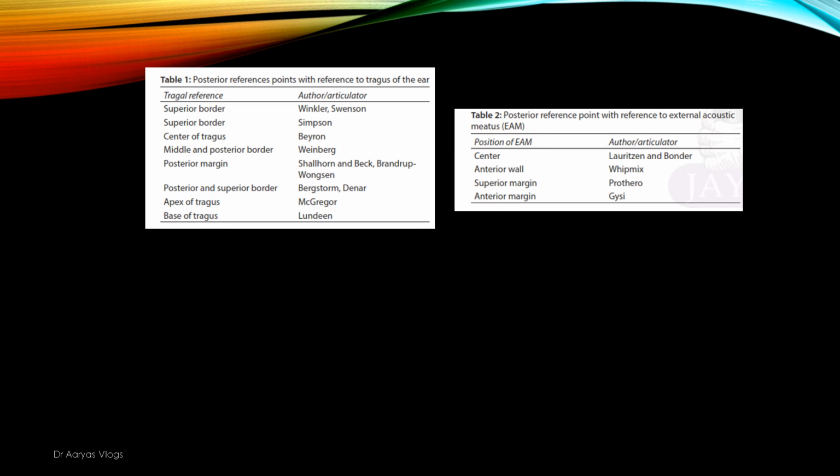Okay. So successful prosthetic rehabilitation, which involves complex modifications in the occlusion, has to be addressed by locating the hinge axis of the patient. And this should almost correspond to the opening axis of the articulator. Maxilla is oriented in space using 3 reference points, and thus it becomes essential for one to be aware of the relative significance of posterior reference points for any occlusal rehabilitation. So that is all about the various reference points, anterior and posterior reference points.